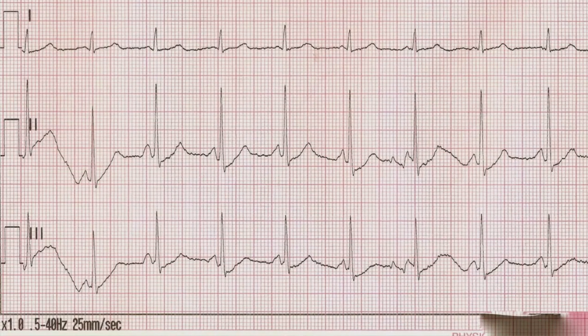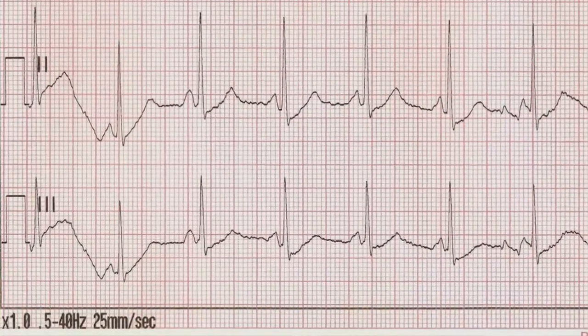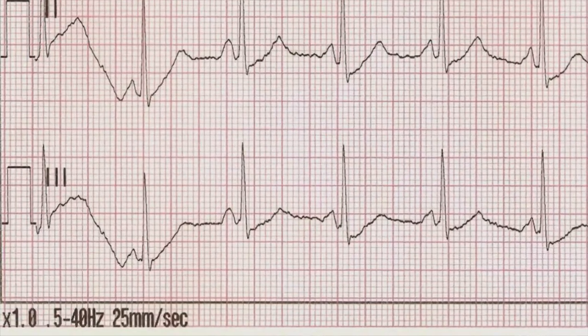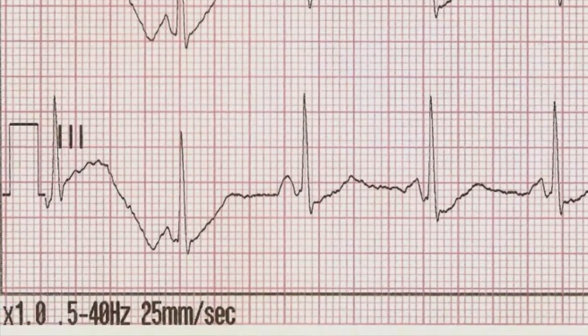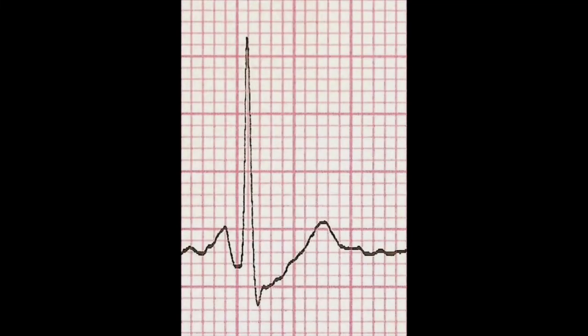Look at the bottom left of the printed EKG and the 12 lead above. The print view is filtering at the 0.5 to 40 hertz level. That is, there's more aggressive filtering going on to smooth the waveforms and rid the EKG of artifact. That filtering, though, can do weird things to the ST segments like, say, depress them by 2 millimeters. Filtering is why you can't print 1, 2, 3, change your view to print the augmented leads, and so on. You can't create a 12 lead that way. It's not the same as pressing the 12 lead button and then getting the results.